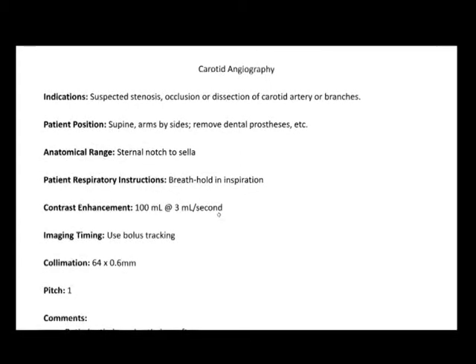Fine, but it's going to be one of those areas that's going to be kind of detrimental to complete accuracy of the scan. Collimation is going to be 64 by 0.6, and the pitch is going to be 1. MPRs and MIPs are going to both be helpful, and to provide the patient with the best scan that we can possibly do.